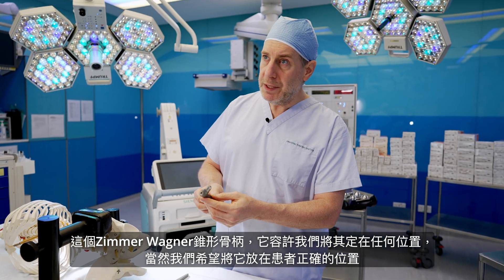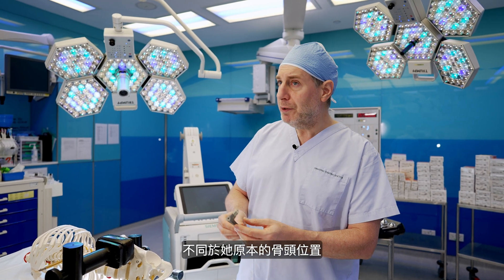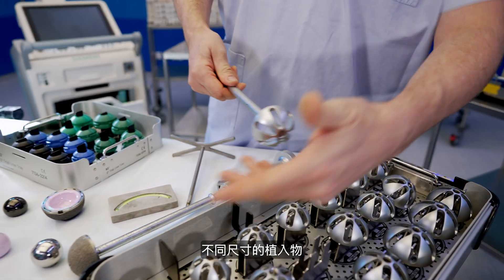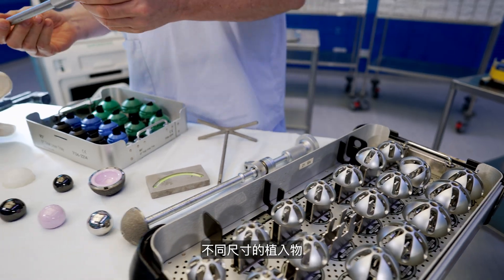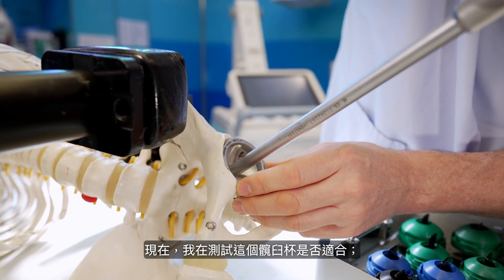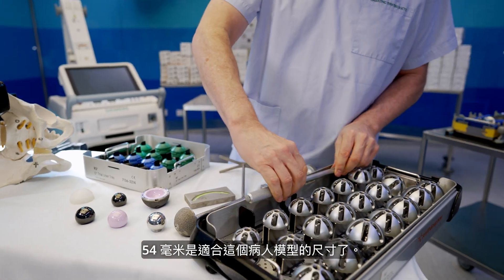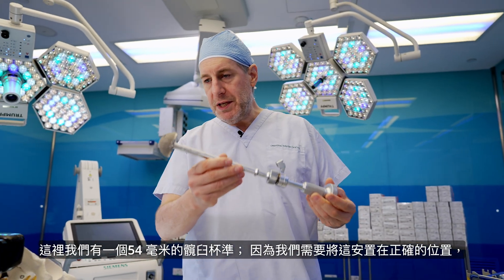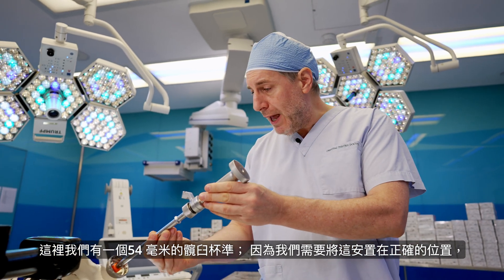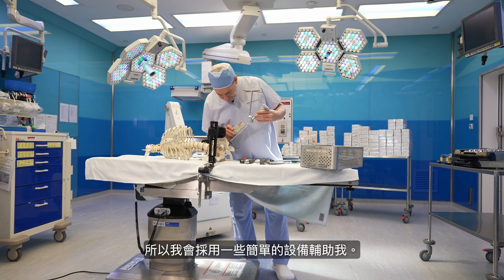And of course, we want to put it in the correct position for the patient, which is a different position from her original bone. We have a whole range of sizes of the implants. Here I am testing the fit of this acetabular cup, and 54 mm is the correct size for this particular patient.